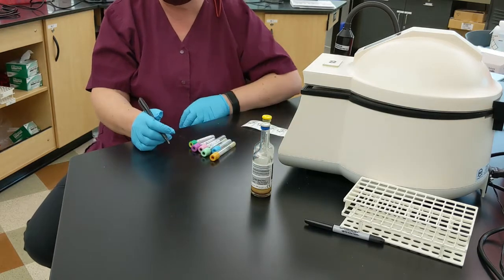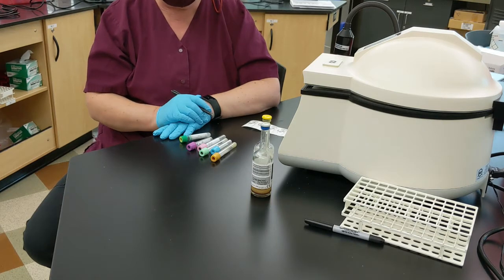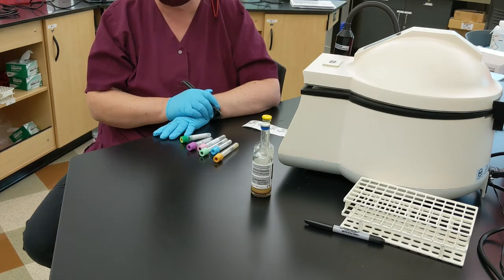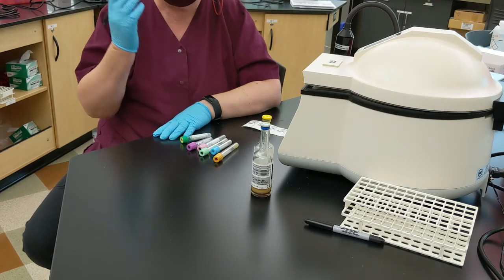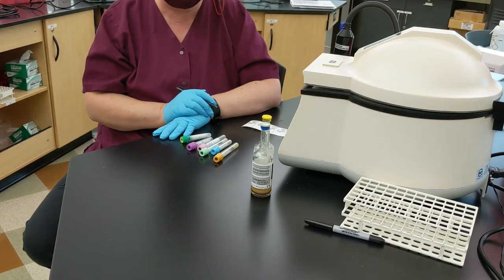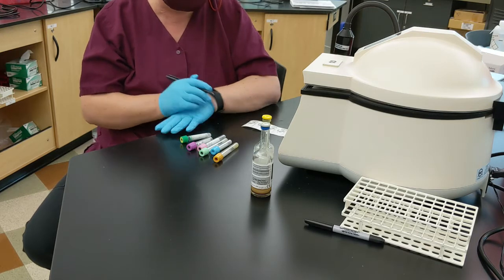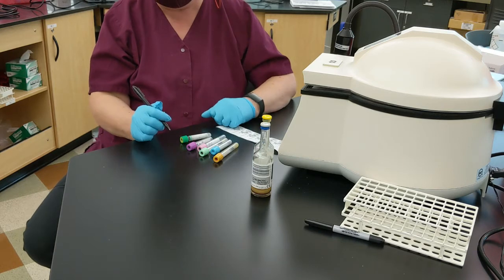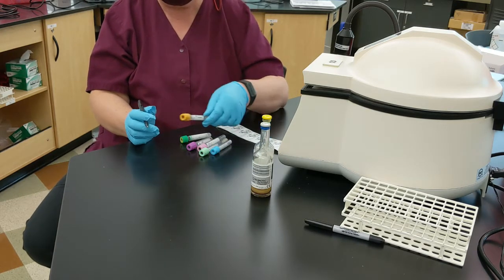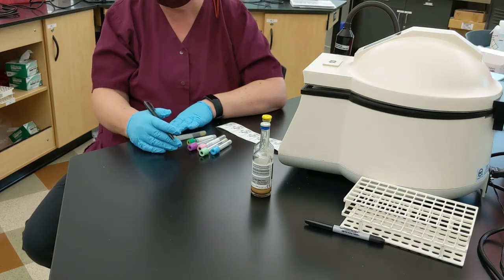So let's go back to what's most typical with our order of draw. You always take a look at your request because you're always going to do patient identification. Patient identification is so important — I can't emphasize it more. Once you know what tests you're going to be drawing, and you have your patient and your labels and everyone's properly identified, you really do need to understand what's happening in each of these tubes as an MLT.